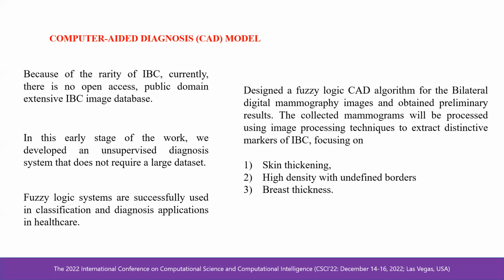In this work, we designed a fuzzy logic CAD algorithm for the bilateral digital mammography images and obtained preliminary results. The collected mammograms will be processed using image processing techniques to extract distinctive markers of IBC, focusing on skin thickening, high density with undefined borders, and breast thickness.